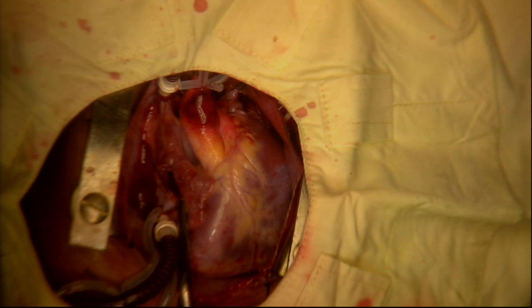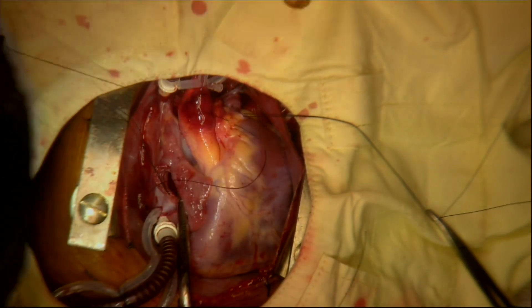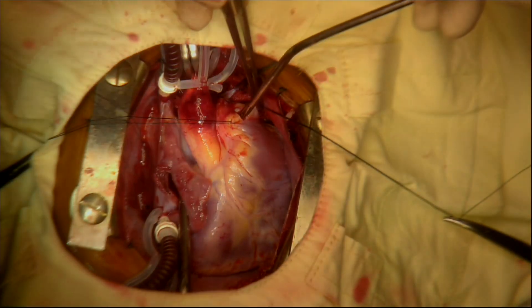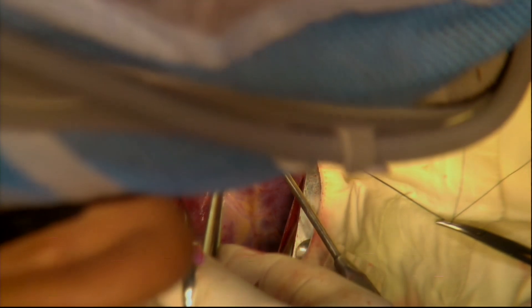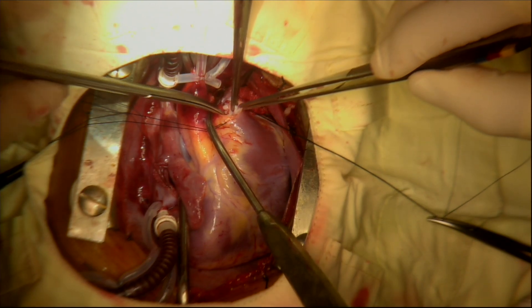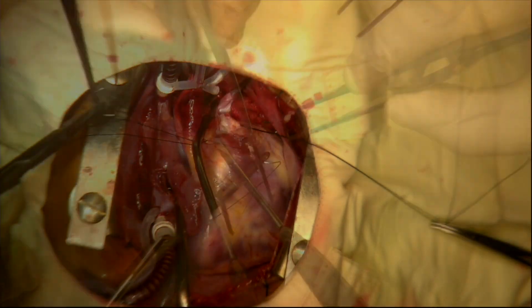Before opening the right ventricular outflow tract, stay sutures are placed on either side of the intended site of incision. Seen to the left of the stay suture currently being placed is the left anterior descending coronary artery running in the epicardial fat next to the suture. The pulmonary trunk is incised between the two stay sutures. The incision is extended headwards towards the pulmonary bifurcation, then extended downwards through the annulus of the pulmonic valve into the front of the right ventricular outflow tract. Further stay sutures are placed to help open up the right ventricular outflow tract.